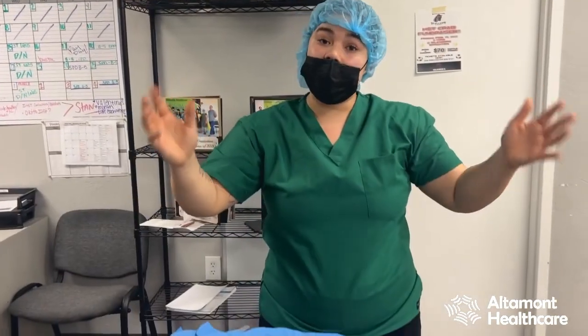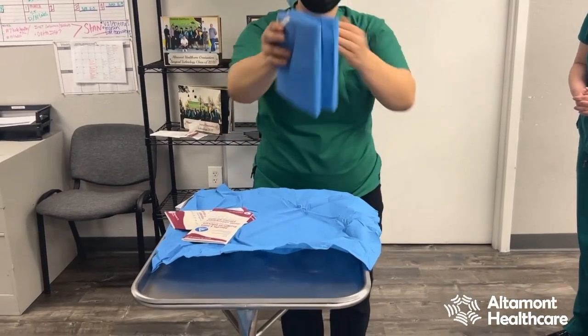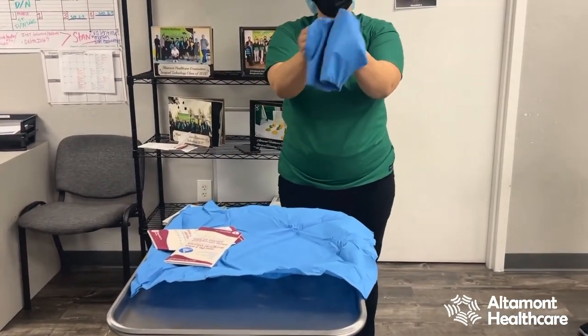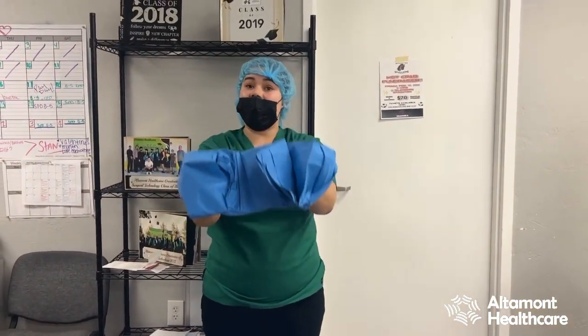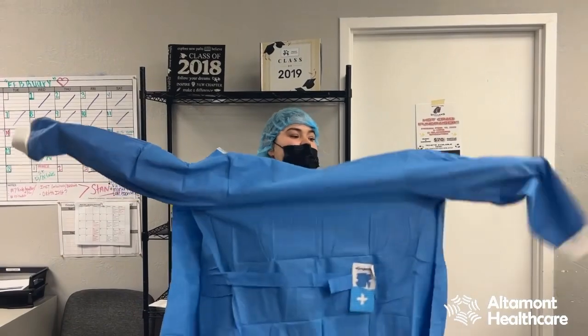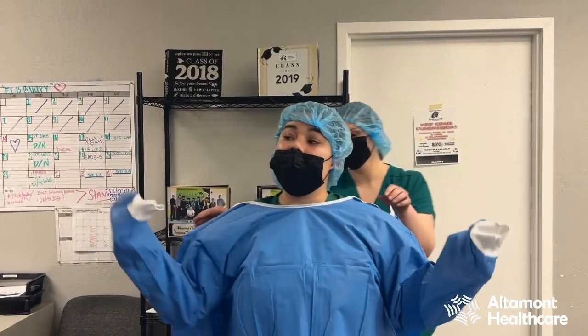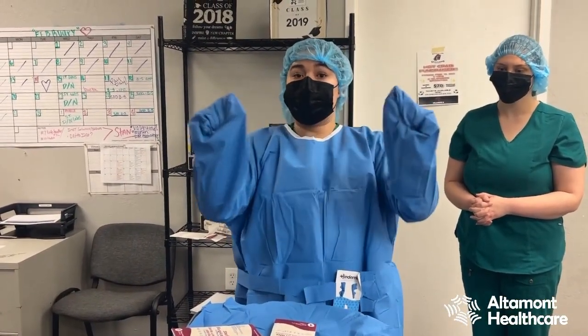I'm going to come up to my field and grab my gown. You want to look at your area making sure you're not going to hit anything once you put your gown on. Now I'll be waiting for my circulator or whoever is in the room to tie me. I'm cuffing my whites so you can only see the blue.